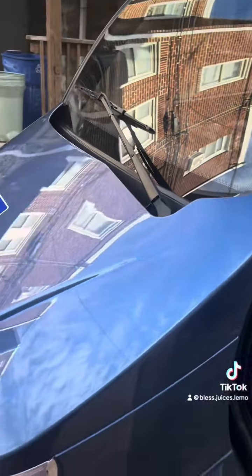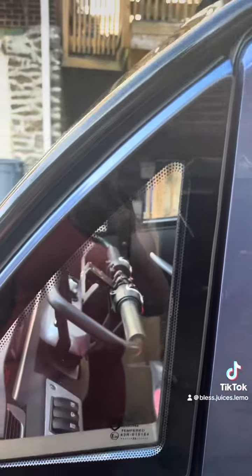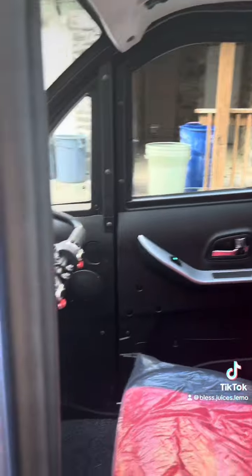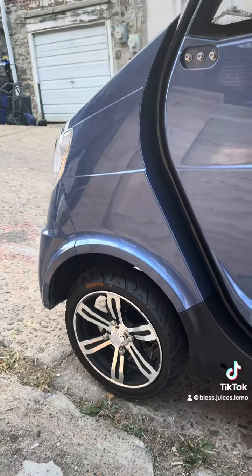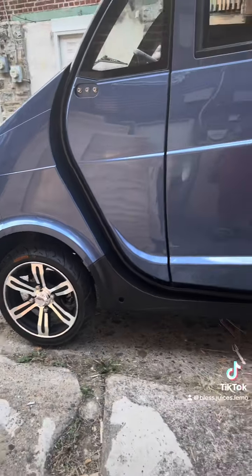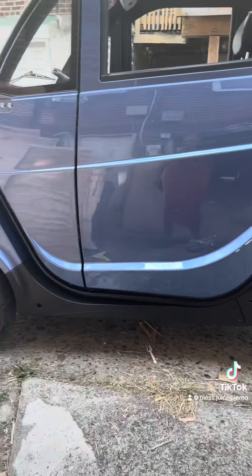This is an enclosed mobility scooter for people that have mobility issues. You don't need a driver's license, you don't need to register it, and you don't need anything else — you just buy it, drive it, and go. Thank you so much, I appreciate you guys.